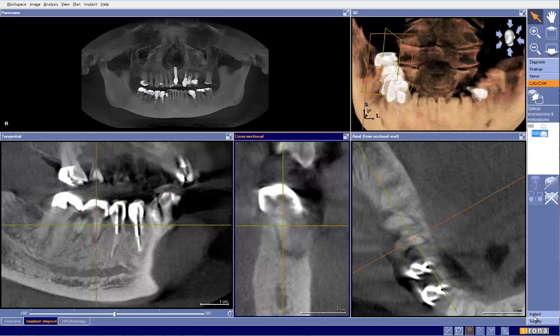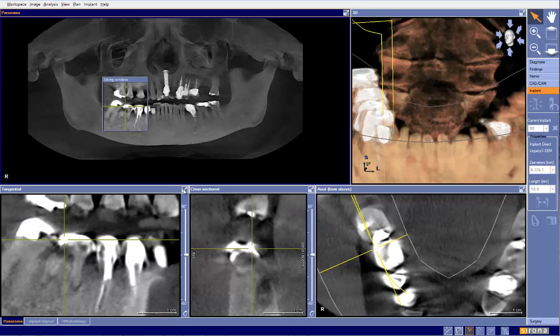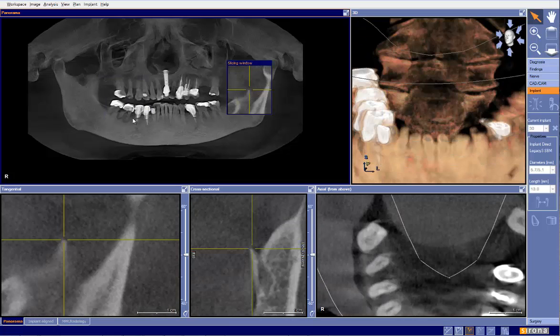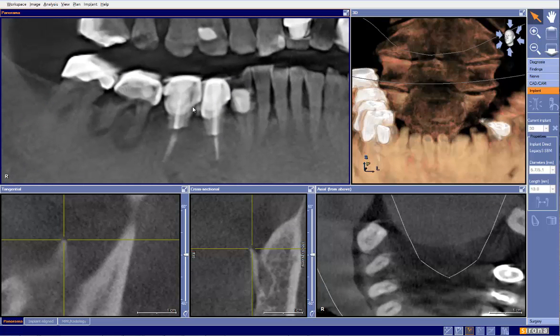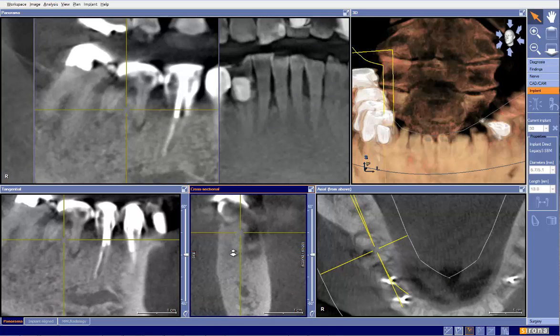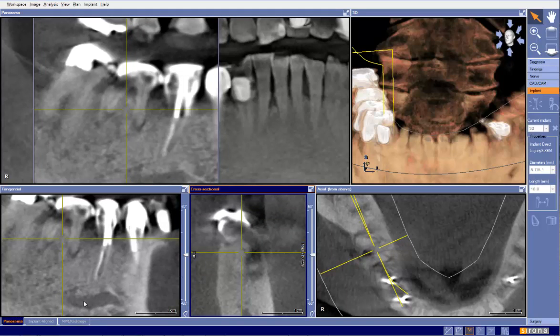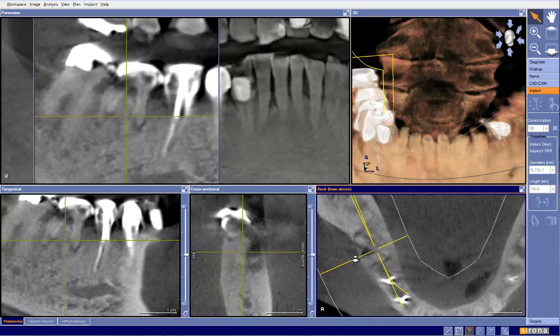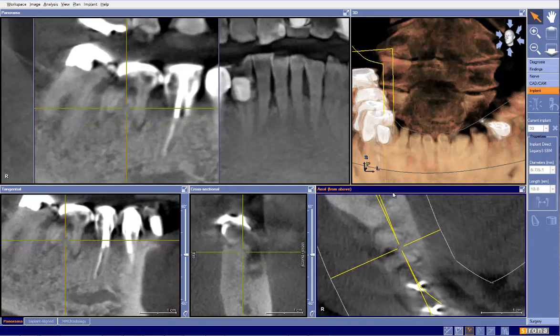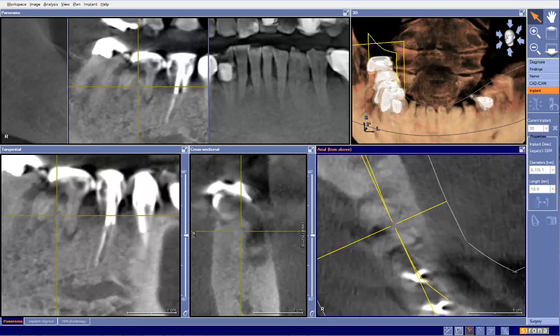I want to focus some attention on doing this case as an immediate placement. Going to the panorama view, the first thing I certainly notice is the amount of infection around tooth number 30. Infection does not necessarily mean you can't place the implant — the key is to totally clean the infection, get all of the semi-infected or soft bone curetted out. The bigger concern with this type of infection is what is going on with the buccal plate. Taking a closer view, based on the amount of infection present, there appears to be a breakage in the buccal plate.